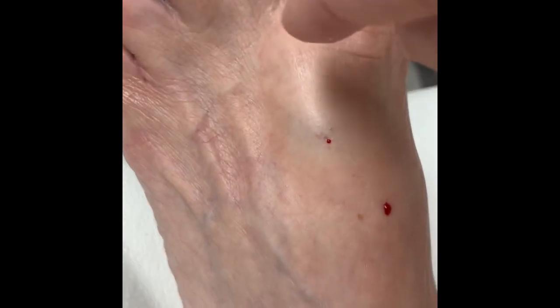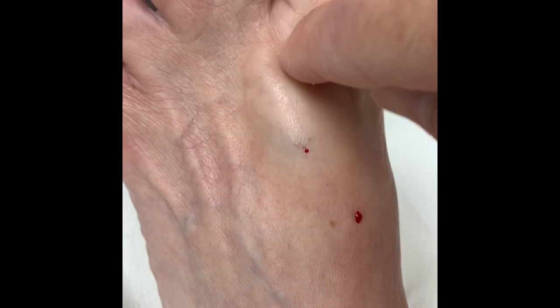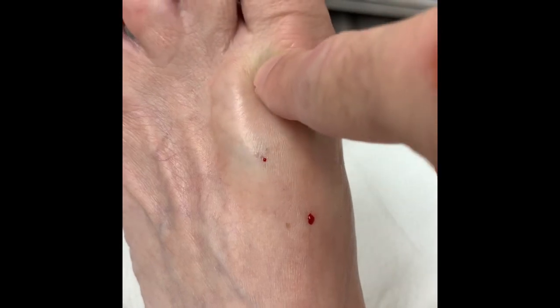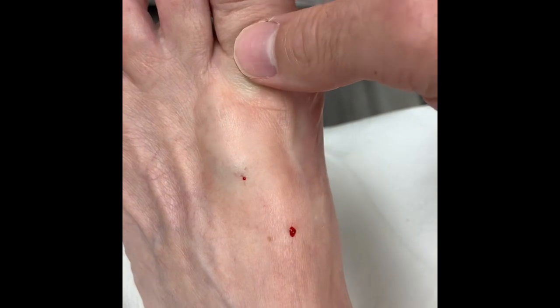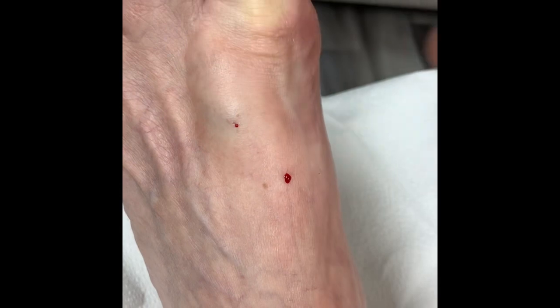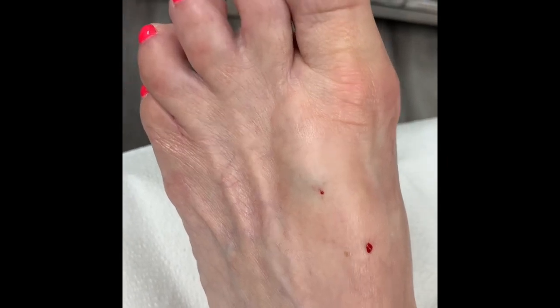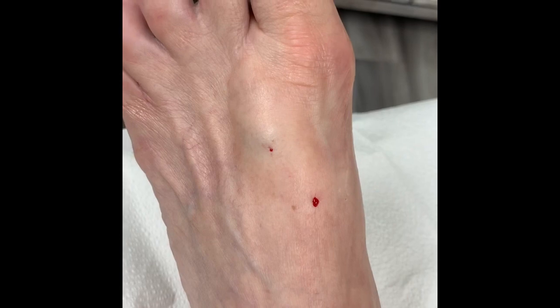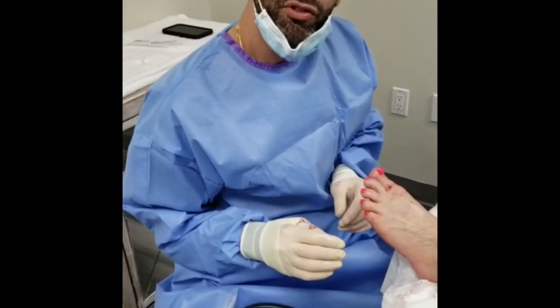Right around this area, she also has another lip of bone, and we're going to really try to grind that out nicely. The goal of the procedure is to give her a little bit more range of motion and reduce this prominence, because every time she wears shoes it bothers her. And that's exactly what we're going to do.